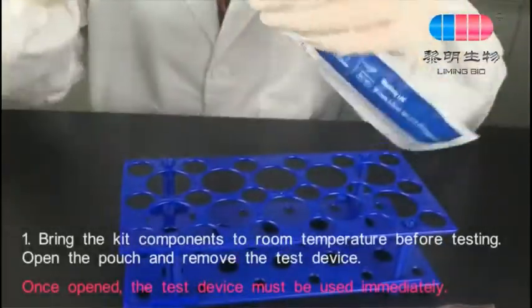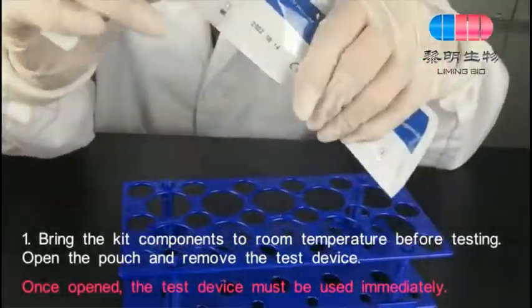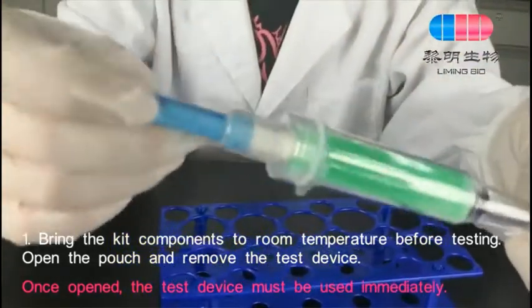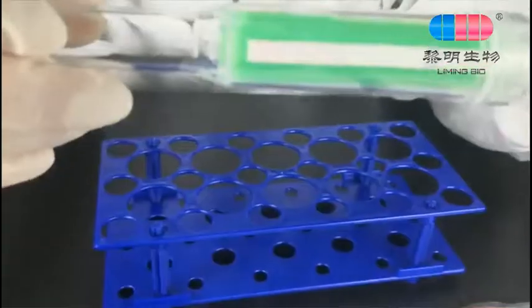Bring the kit components to room temperature before testing. Open the pouch and remove the test device. Once opened, the test device must be used immediately.